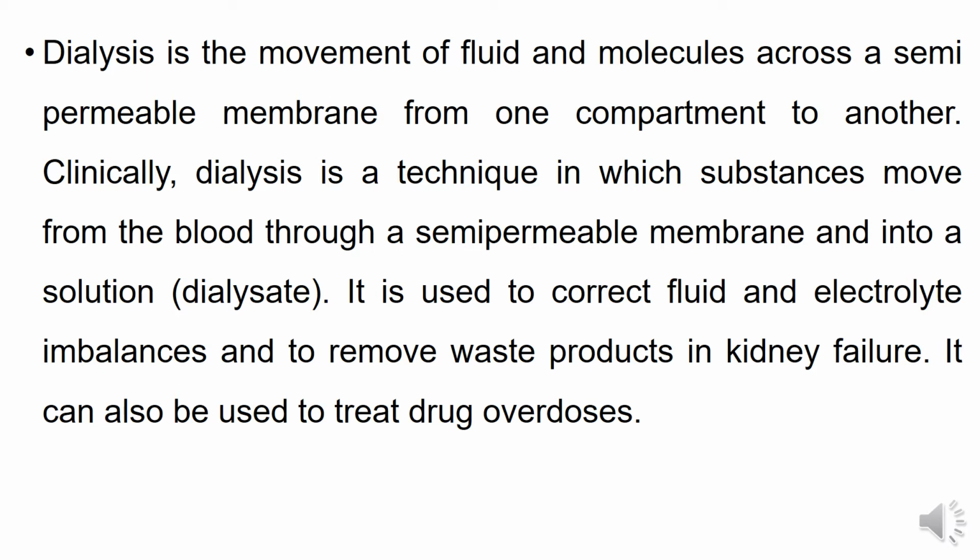The main purpose is to correct fluid and electrolyte imbalances and remove waste products. Dialysis means the removal of waste products and purification of the blood and fluids. We use this dialysis technique when the kidneys fail, and some other indications are also present, like drug overdose and toxins. These are some of the indications for dialysis.